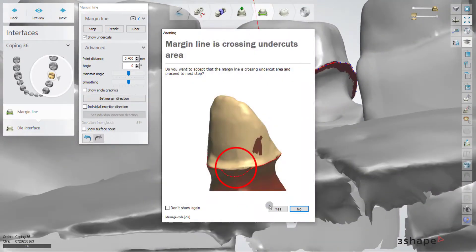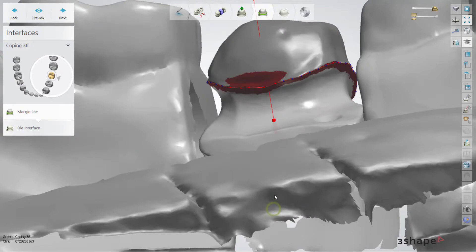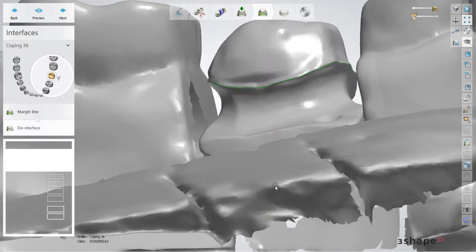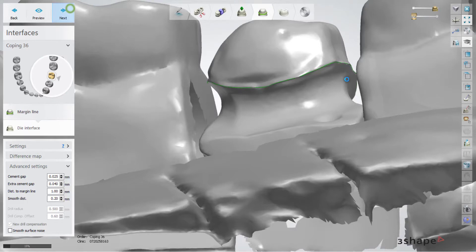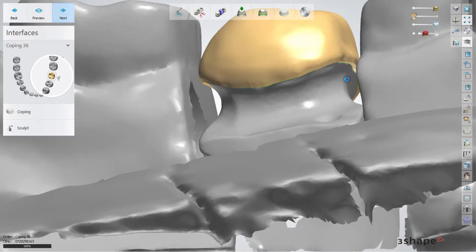Or if there is no other option, we say that it's okay and we want to continue with this condition. Then we will specify the cement gap, extra cement gap, and extra.